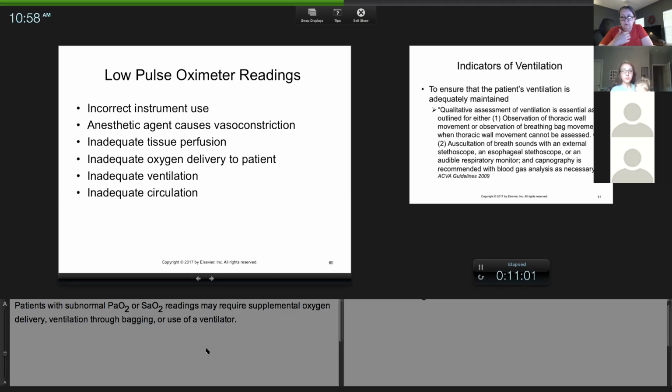Now obviously if your patient was showing a super weird ECG or starting to breathe very strangely and you get this reading, you have to do this fairly quickly. I'm not going to spend 15 minutes. I can troubleshoot the probe pretty quickly. Is it on the floor? Is it dirty? If it's in the rectum, is it in stool? Do I have it placed upside down? Is it plugged in? So one of the first things is I check my probe.